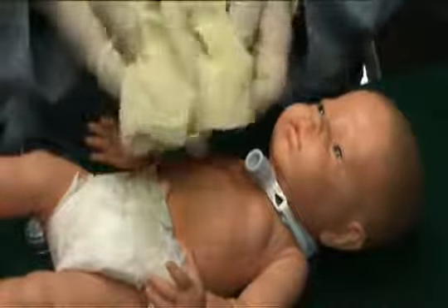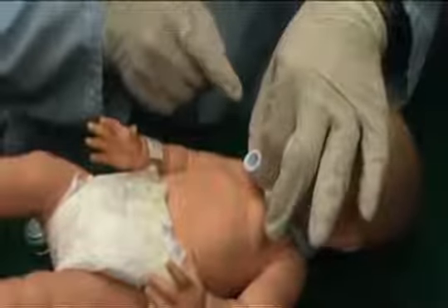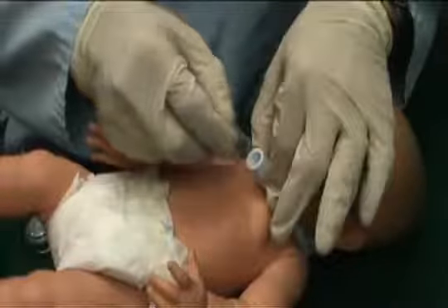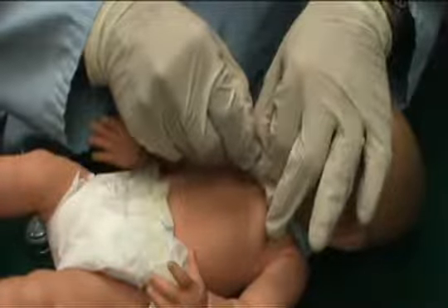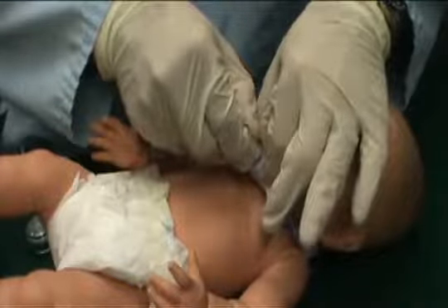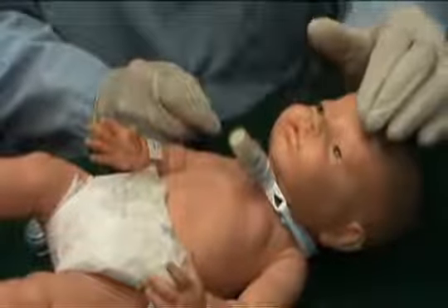After that, you'll need to stabilize the base of the connector with one hand to minimize movement and trauma to the stoma. Next, connect the HME to the top of the tube's 15 mm connector with your other hand. Gently press downward until you feel resistance, and then continue to gently push down while simultaneously twisting the HME with a quarter turn. You should practice applying each accessory to the 15 mm connector several times to gain experience with the appropriate downward pressure required.